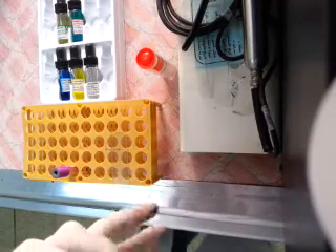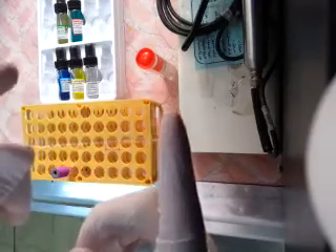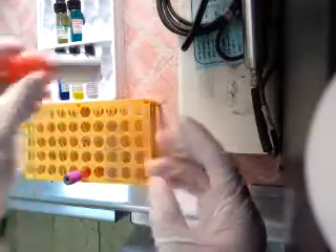Hi guys, welcome. This is the test for blood group. We will use a dry and clean slide, and blood in EDTA tube — capillary tube — with anti-B, anti-A, and anti-D for RH.